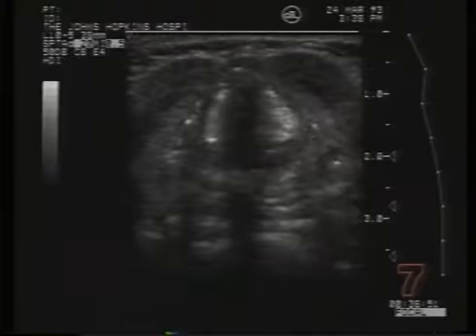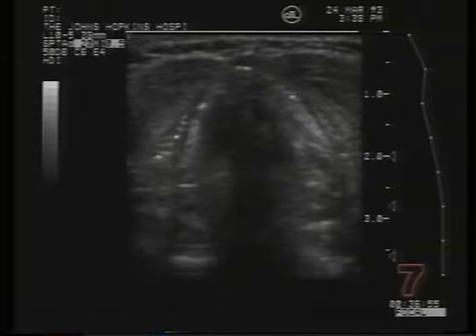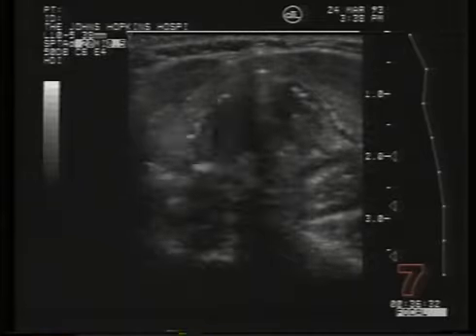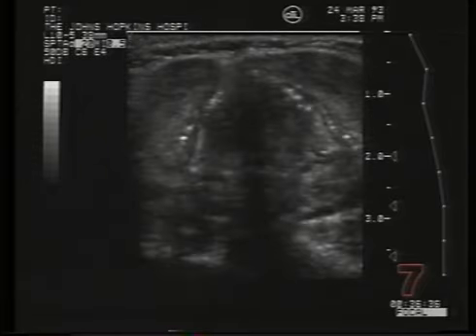I'd like to start by having you just say ah, ah, ah. Go ahead. Ah, ah, ah. Good. In this image, we can see the vibration of the vocal folds a little bit and the opening and closing as it goes into the ah. Though, of course, in fact, the vibration of the vocal folds is too fast for the video frame rate. We also see the vocal folds opening and shutting abruptly for the cough.